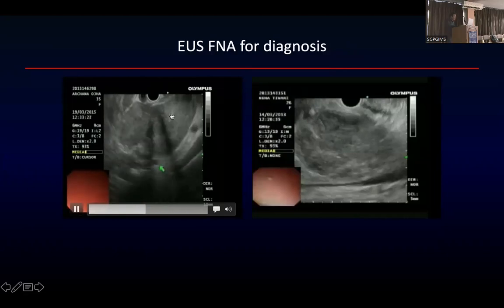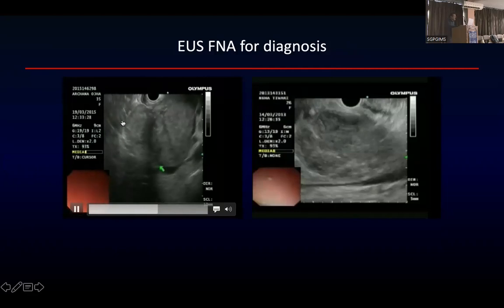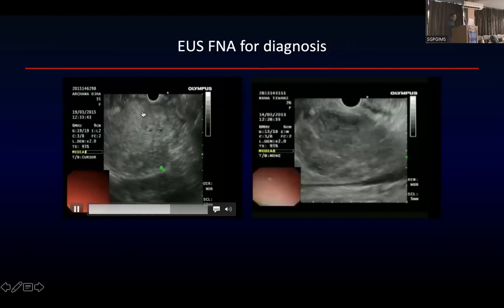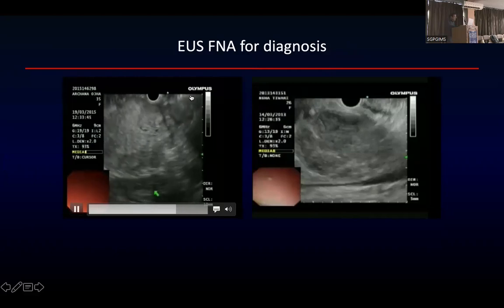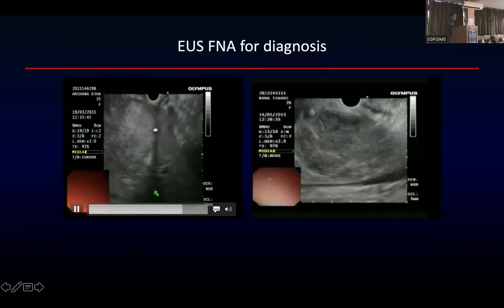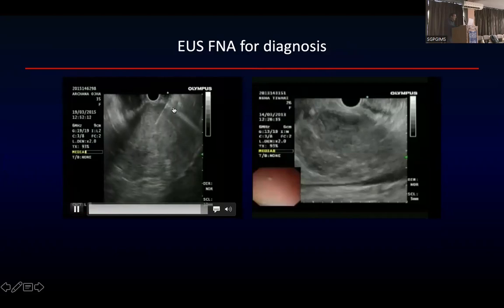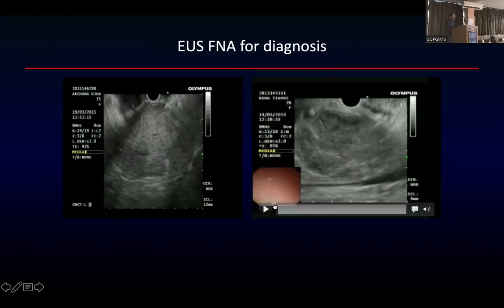So this is a very large mass. Young girl, ये अर्चना, I think she's 2015. So this is a mass. You first apply Doppler and then puncture with, at that point of time, I think we had only FNA needle, not FNB. Otherwise, as of today, I would have done an FNB. ये needle जा रही है, एक pass आपने किया. Yes, then you have to take multiple passes.